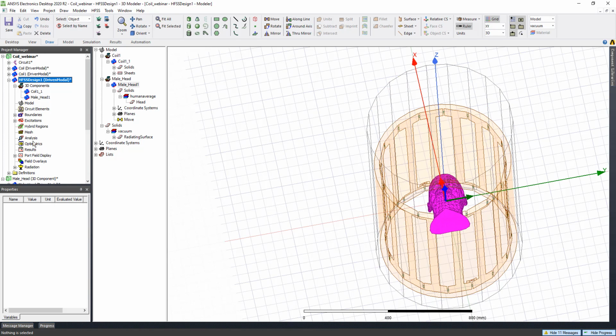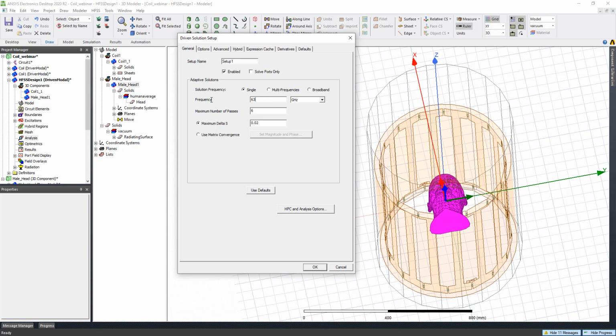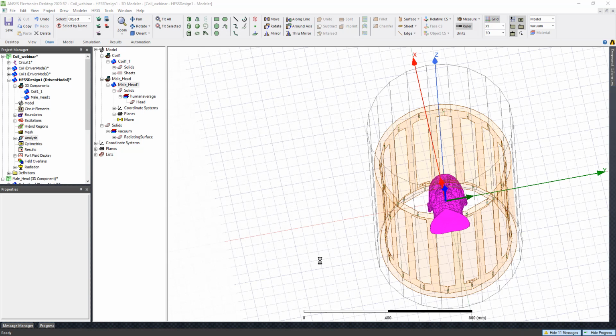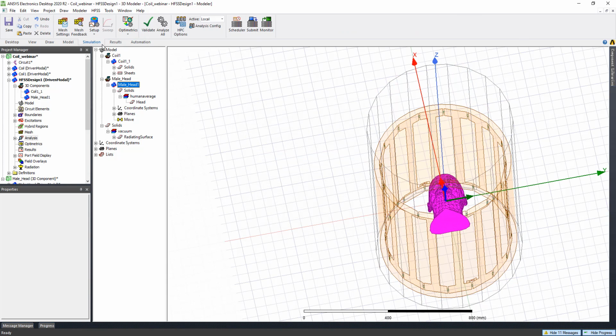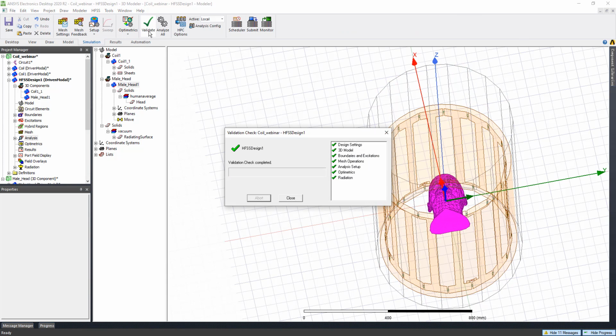Next thing I want to add is the analysis setup. Just do it for a single frequency and maximum iteration 20. Click OK. So I don't need any sweep. And go ahead and validate it. Everything is green, and now I have it ready to run.